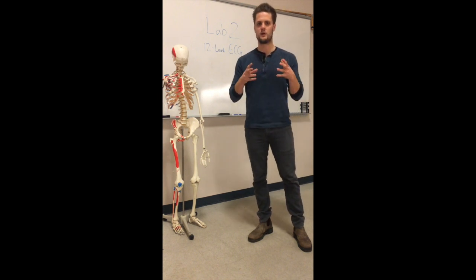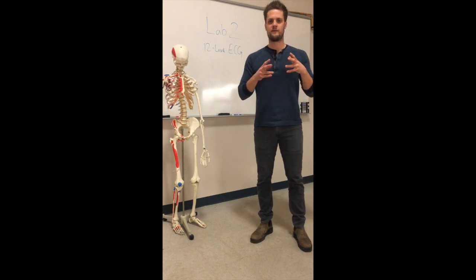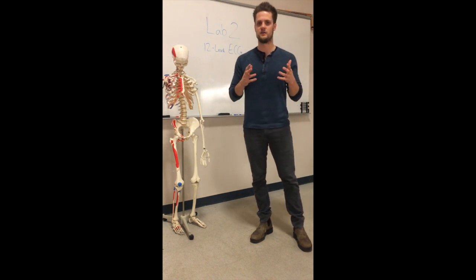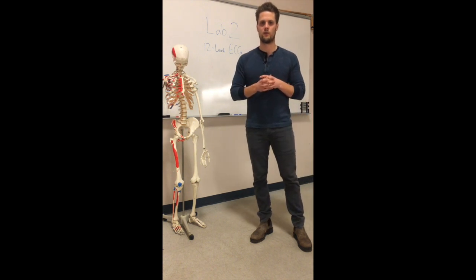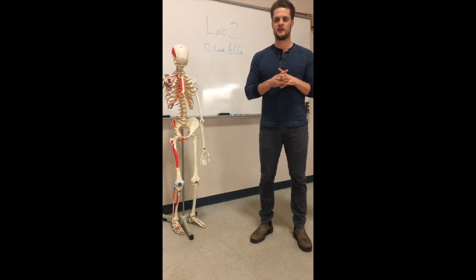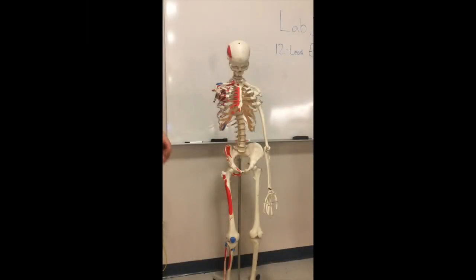but first it's important to note that when you're here in lab doing a 12-lead ECG, this is a lab for a learning experience, and we are not trained professionals. So if there's any concerns with the ECG that you get, please consult a physician and go forward from there. So first, let's go through the placement of the electrodes, and then we'll go over exactly how to interpret the ECG. Now, first we'll show the placement of the 4 limb electrodes.